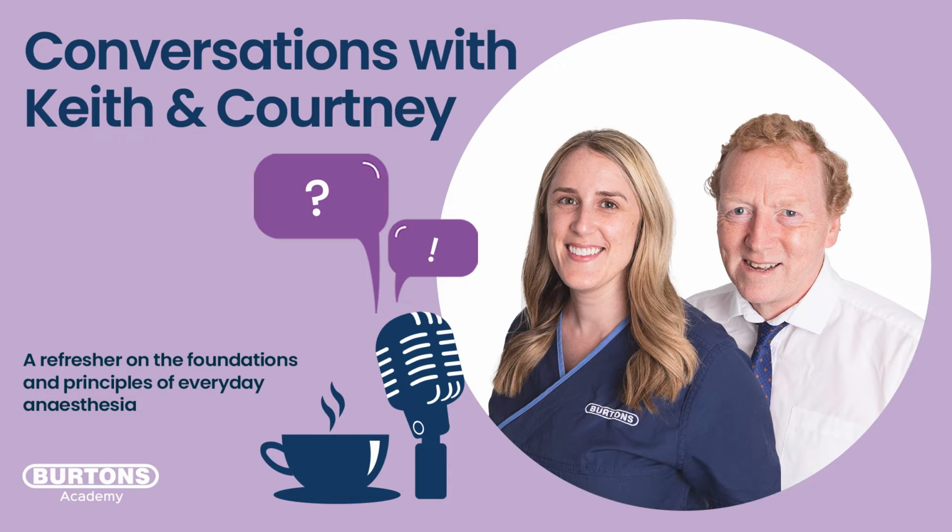Our job as anaesthetists is to determine which of those three elements has occurred. Now, I took one example of production. It's probably the least likely thing to change during an anaesthetic, because the animal's at a constant temperature. It's unlikely to have hyperthermia or particularly hypothermia, because it's in a nice warm anaesthetic theatre. So that's the one that's least likely to change.